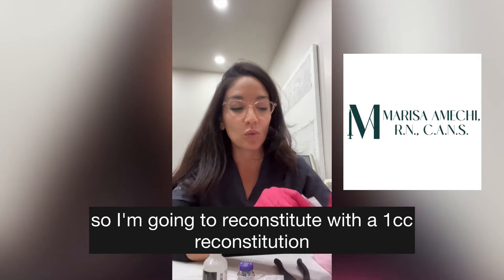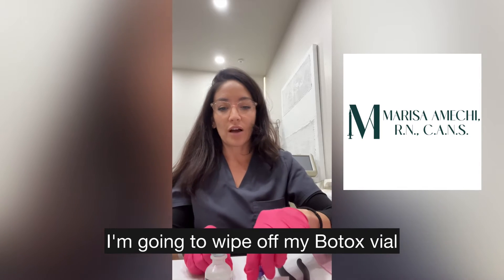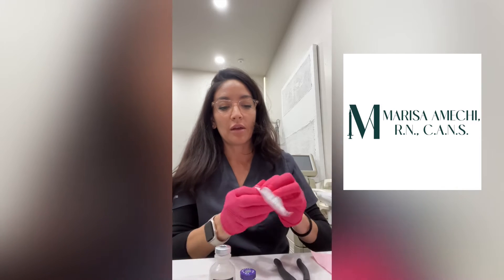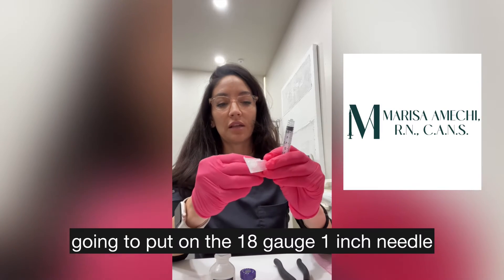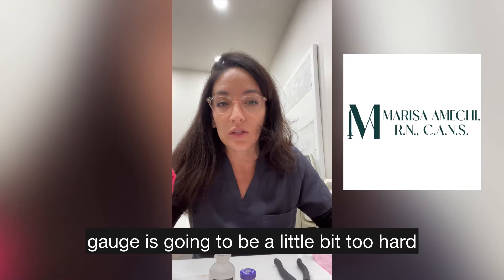I'm going to reconstitute with the 1cc. I'm going to use my alcohol swab and wipe off my bacteriostatic saline, then wipe off my Botox vial. There is a little cap — I already took it off, you just flip it with your thumb and it comes right off, but I do an extra swipe with the alcohol swab. Then I'm going to open up my 3cc syringe and put on the 18-gauge 1-inch needle. Anything smaller than a 23-gauge is going to be a little too hard to drop the saline.